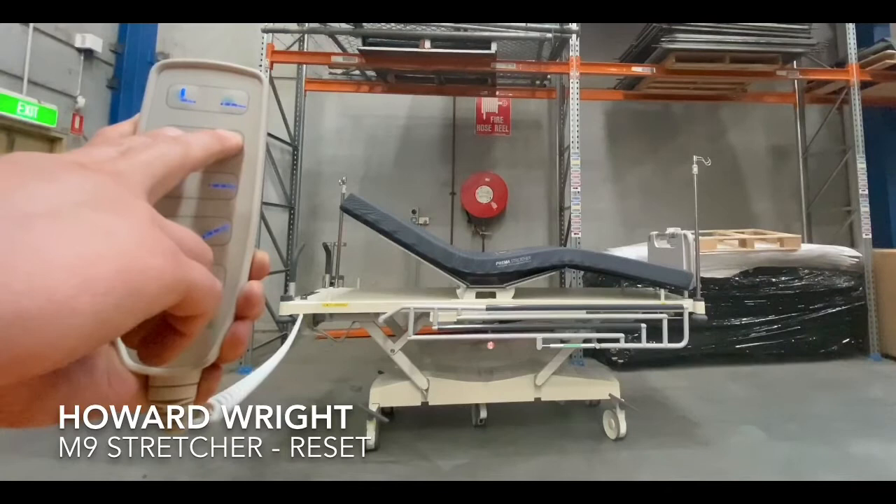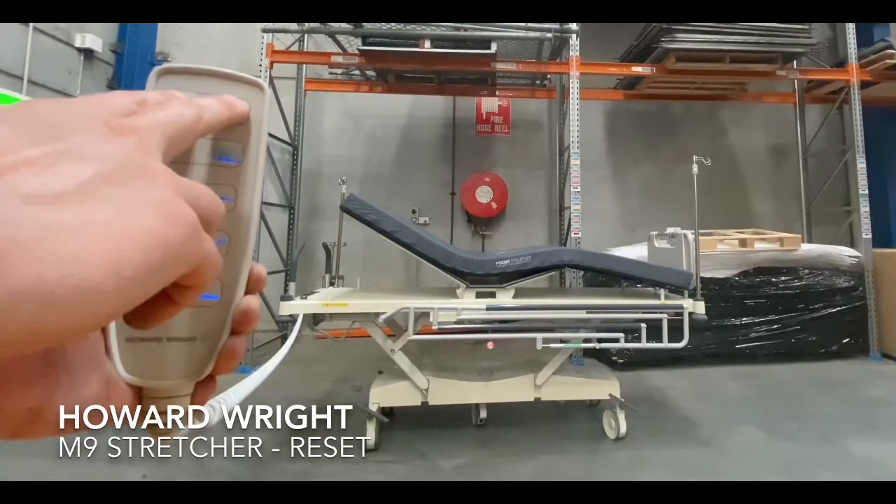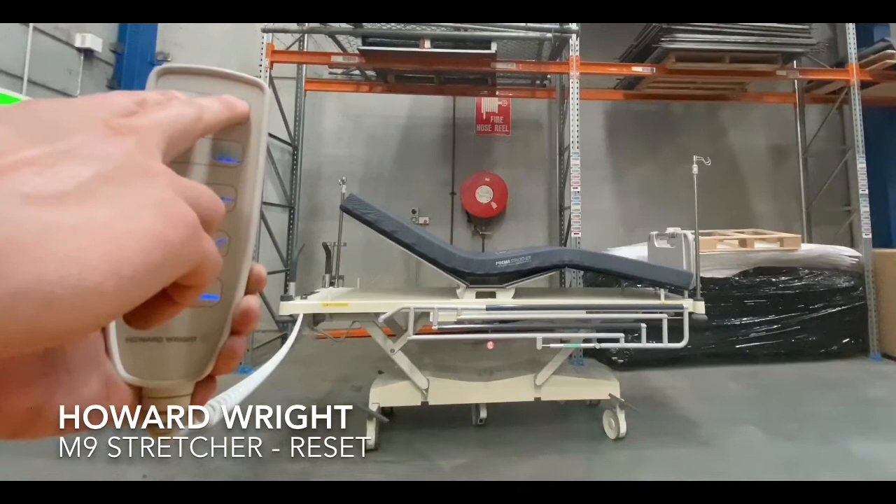The unit will beep 10 times. When it finishes beeping, you can move on to the second step, which involves pressing the backrest up and backrest down buttons simultaneously. The unit will raise, the deck will flatten, and it will confirm initialisation with two beeps.